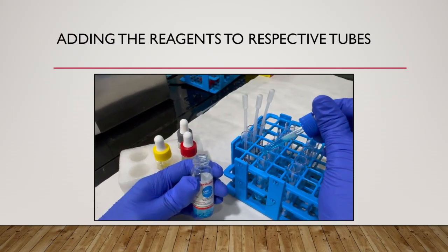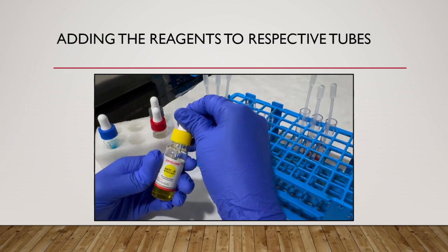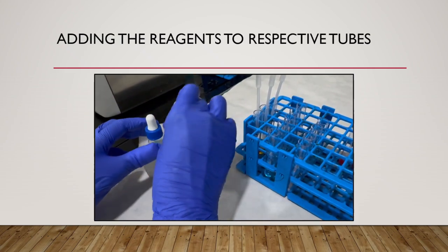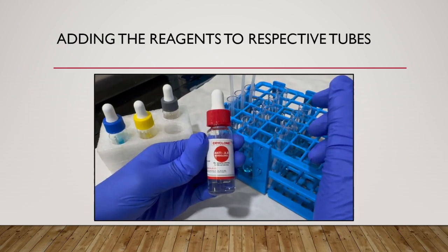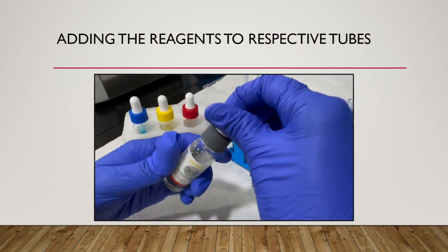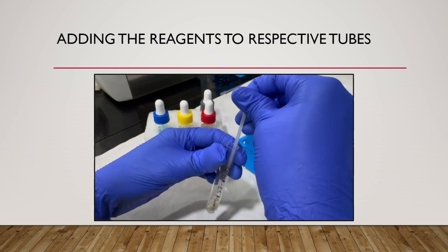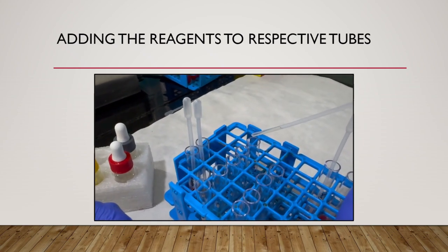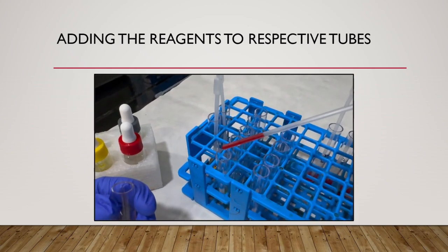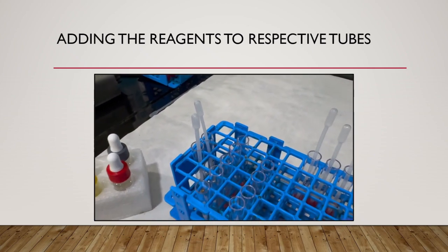Now we are proceeding to the testing as per AABB guidelines. Here we are adding 1 drop of anti-A to the corresponding labeled tube in forward grouping, 1 drop of anti-B, followed by 1 drop of anti-AB and also 1 drop of anti-D to the corresponding labeled tubes. And at last in forward grouping, we are adding 1 drop of 6% albumin as a control. Now we are adding one drop each of 3% red cell suspension of the patient to all the tubes of forward grouping.